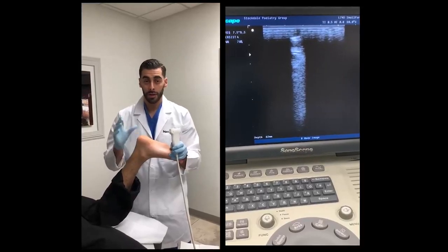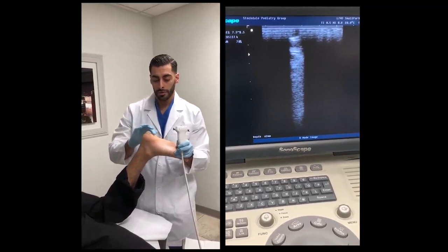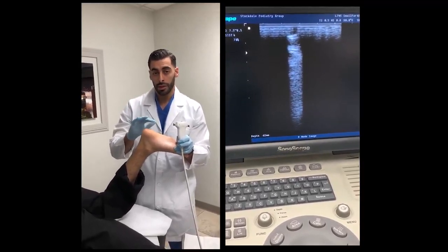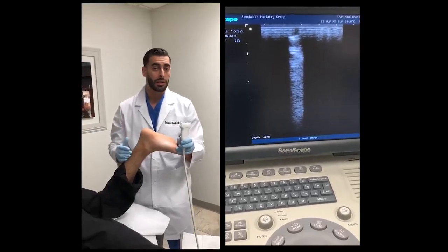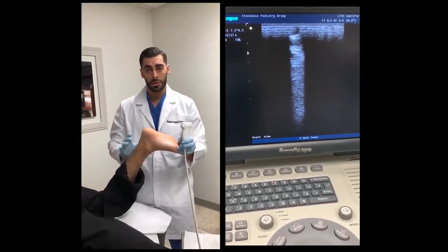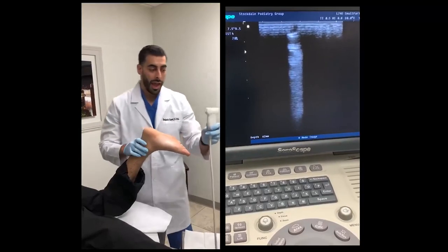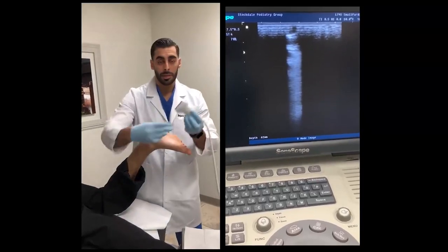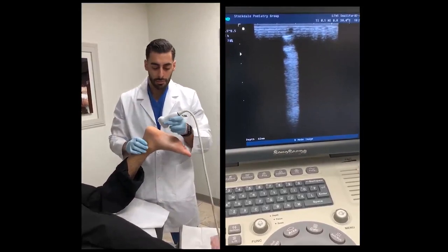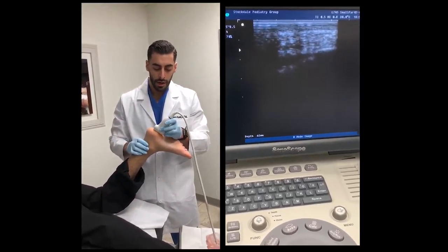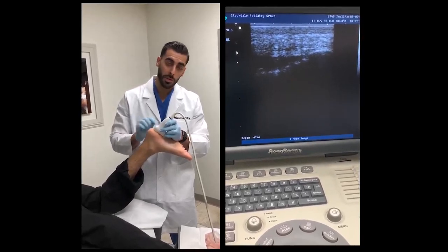For using an ultrasound machine to diagnose and treat plantar fasciitis, it's important that your patient is in the prone position. It can be done in the supine position, however it's a little bit difficult with handling the foot. Place the probe in the longitudinal axis onto the heel and move your way towards the midfoot.